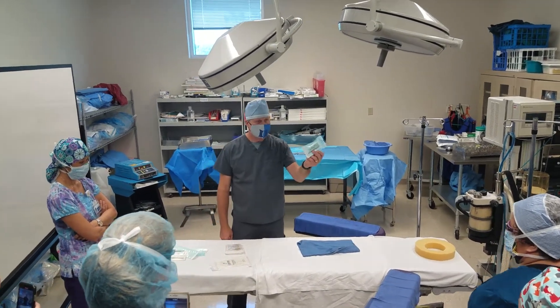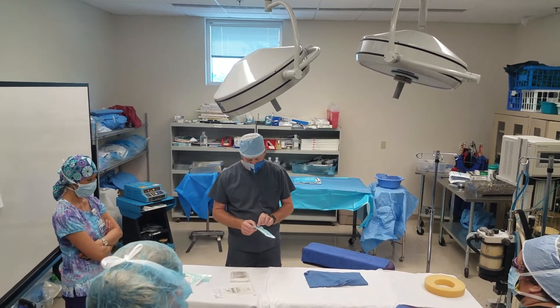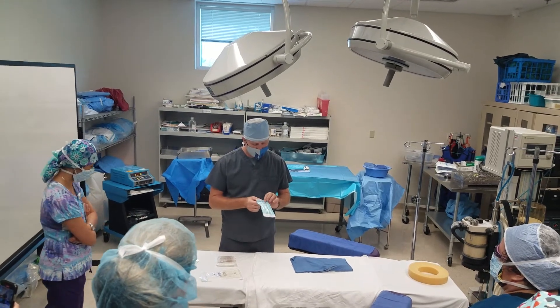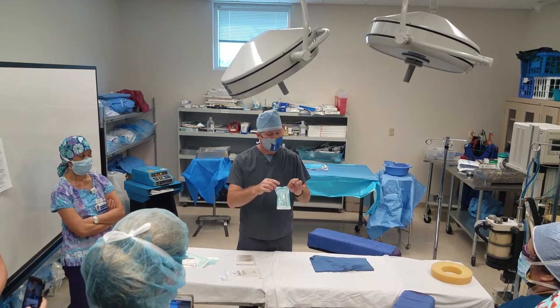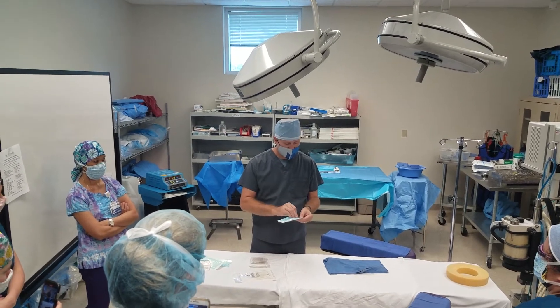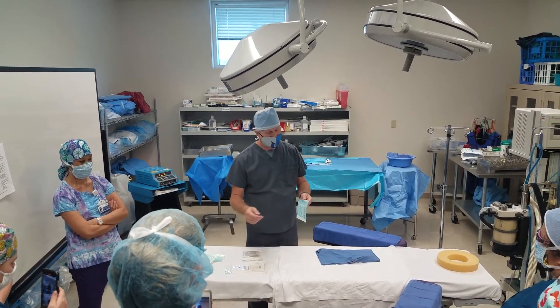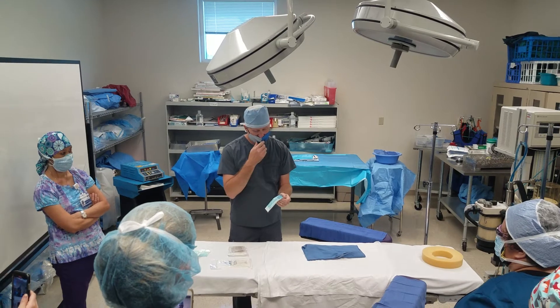Sutures — these are called peanuts. Let's open that and talk about it. How do you open sterile items? Typically, especially something like this, it was sealed — manufactured sealed all the way around. We're going to peel it from this end. Usually the corners have something that sticks them down — pop that first, run your finger down there and open it up. Now you've got that tab free. Your gloves and other things work the same way. I'm going to grab it with both hands and peel it apart, never touching the inside.